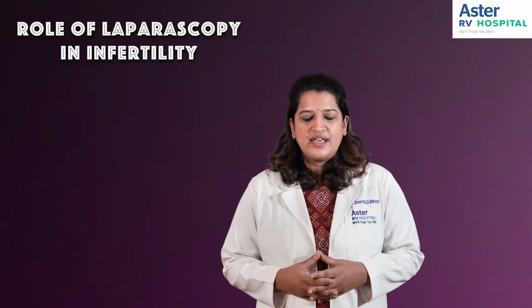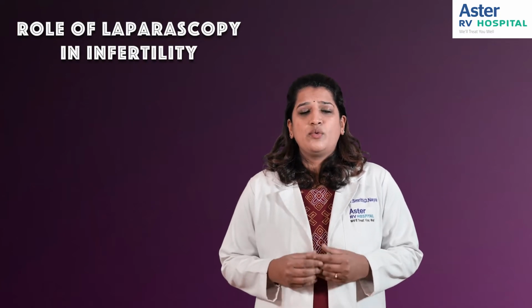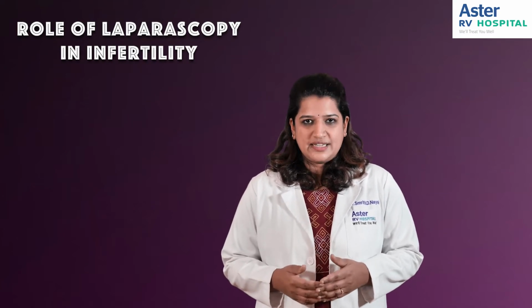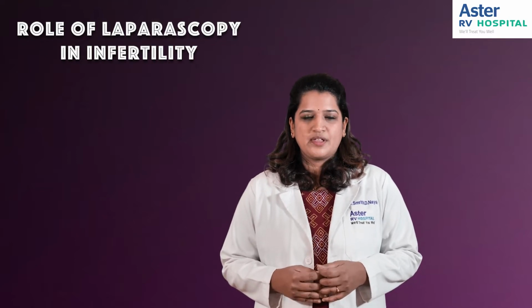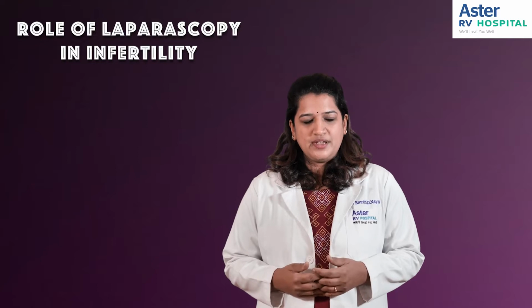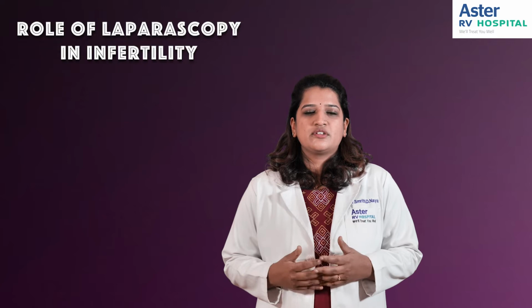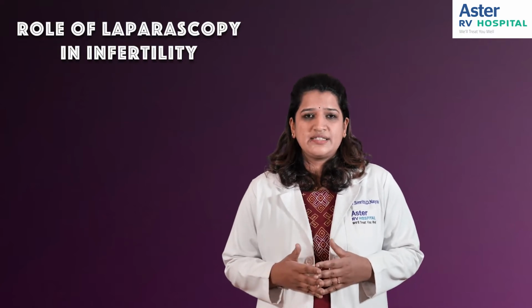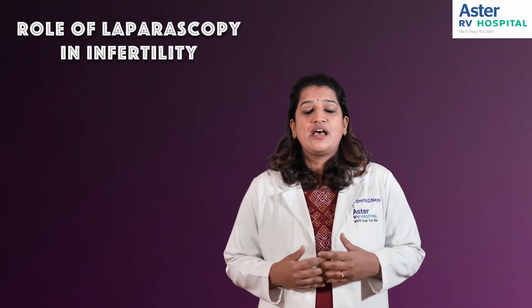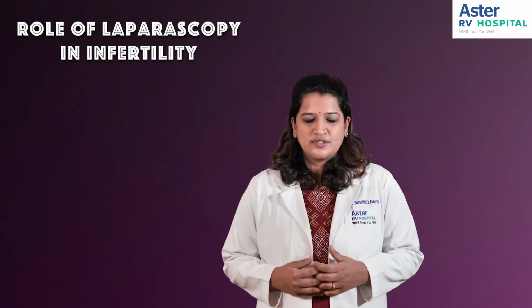Today I will be talking to you about the role of laparoscopy in infertility for successful pregnancy. With the increasing number of infertility cases, active intervention is the need of the hour. Hysteroscopy and laparoscopy are simple daycare procedures that can be done to diagnose the cause of infertility. There are multiple reasons because of which these surgeries are advised to patients. Some of them are as follows.